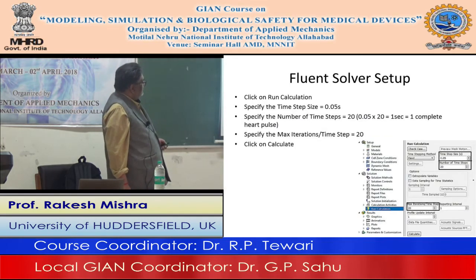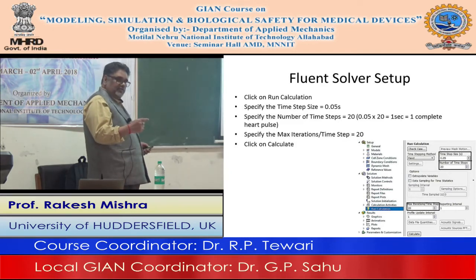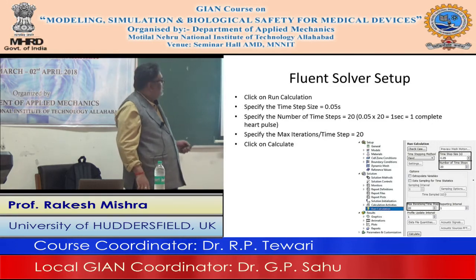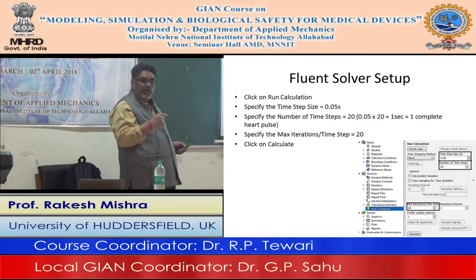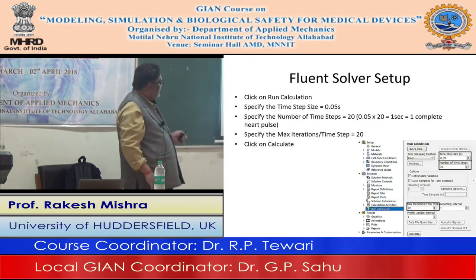But now under transient simulations we have to provide some additional information, that is how close the time steps would be. Like the first time step is 0, the second time step will be 0.01, 0.001 or 0.05. That is dictated by the memory you have, or how big the system is. So we typically take, in this case, 0.05. Every 0.05 second, what is the flow that we are simulating? If you're doing a very complicated simulation, take 0.01, take 0.001, depending upon how closely you want to monitor the flow. So in this case, that is what is happening.